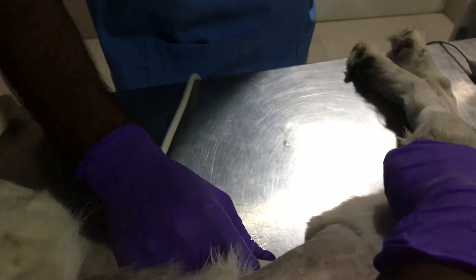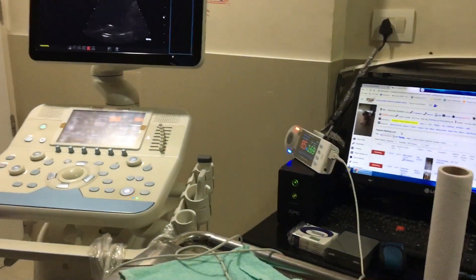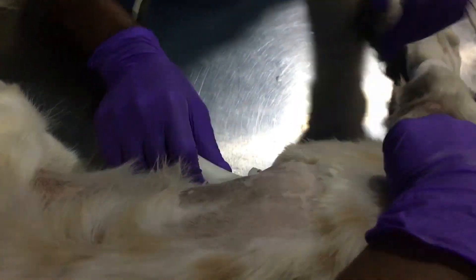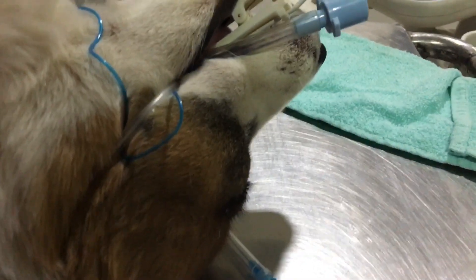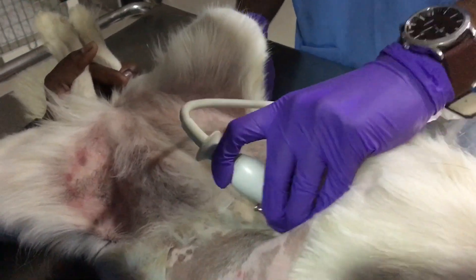Before taking the biopsy, we need to do a survey ultrasonography to check how the organ appears and where the lesions are exactly located. This helps the doctor target the biopsy precisely. The dog is placed in ventrodorsal position and is in surgical plane — you can see we are monitoring it here.